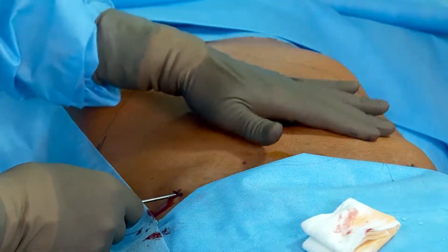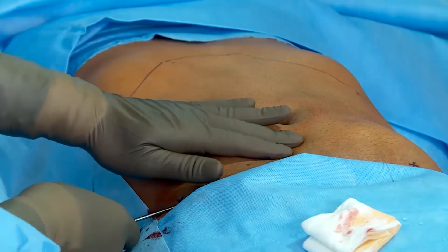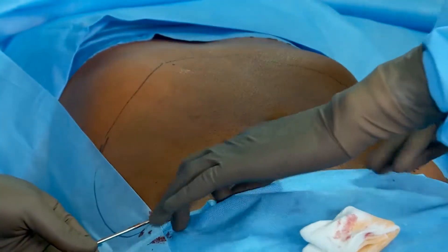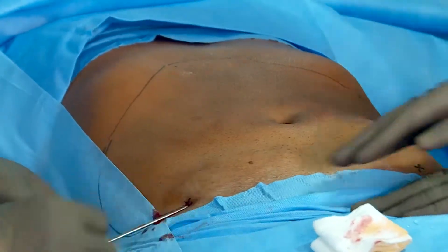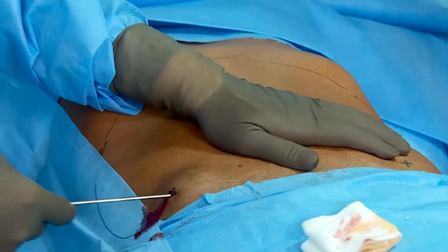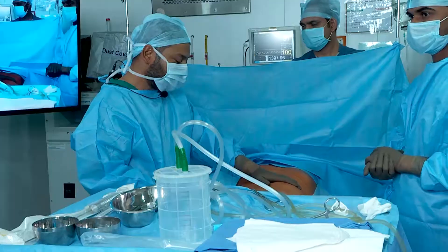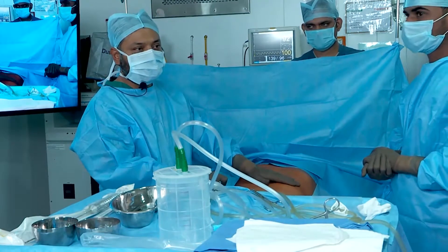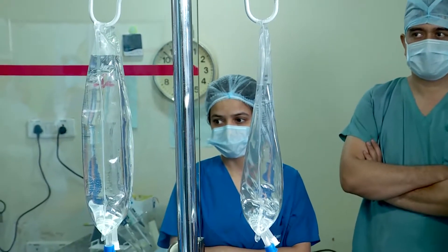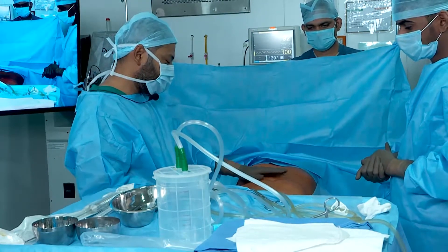You can see this bulge — the fluid is gradually accumulating. Regarding the composition of this infiltrating fluid: it consists of 1 liter of normal saline added with 1 ampoule of adrenaline, 1 ampoule of soda bicarb, and 40 ml of xylocaine 2%. We have prepared and kept ready 2 liters of such fluid for tumescent anesthesia.